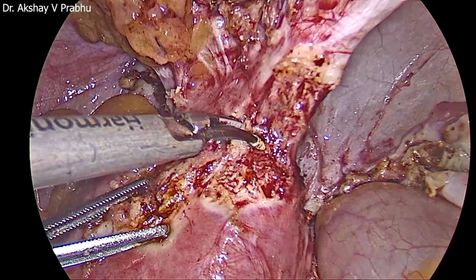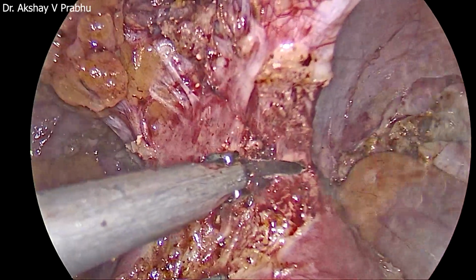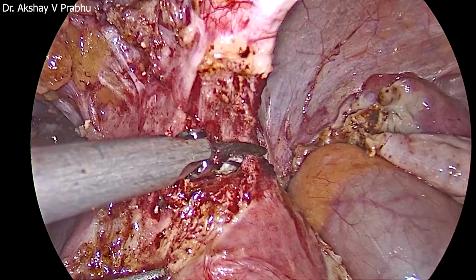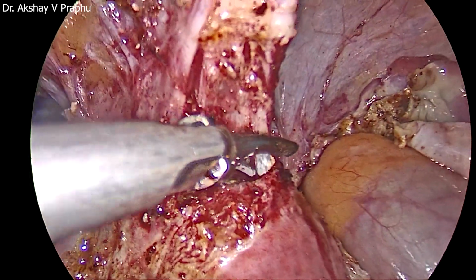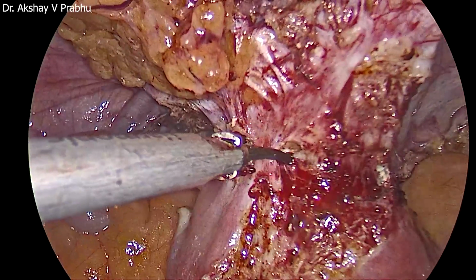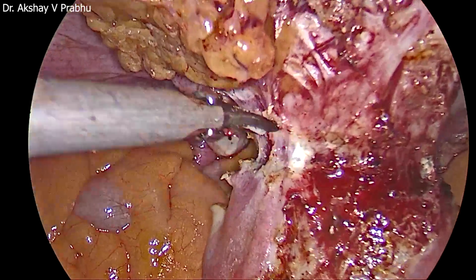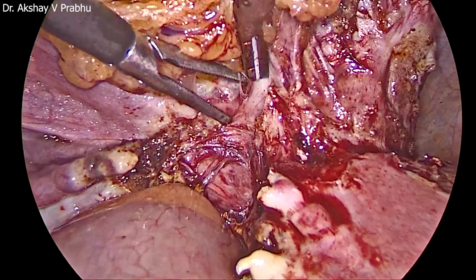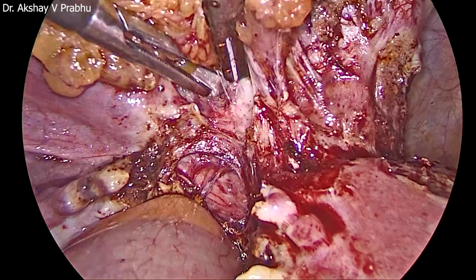So now from the lateral side, again I've come to the central dissection, trying to find a plane from this angle, cutting millimeter by millimeter. Skills and more importantly patience is of utmost importance in such cases. A lot of people tend to give up in the middle, saying that they're not getting a plane, but mind you, even if you open up such cases, it's not going to be very easy. In laparoscopy, you get the lateral approach. That's the benefit and the better visualization. So now slowly we are opening up certain planes.